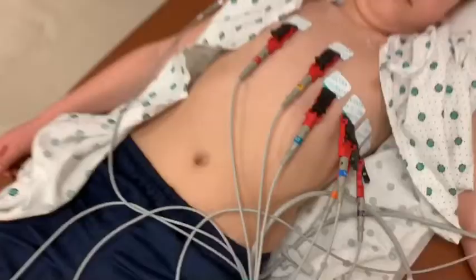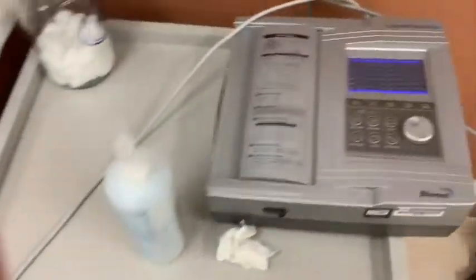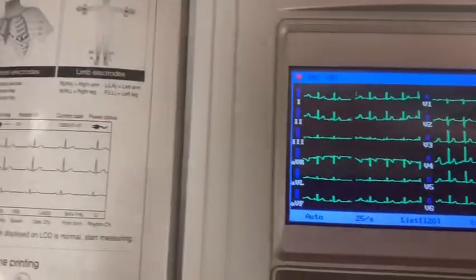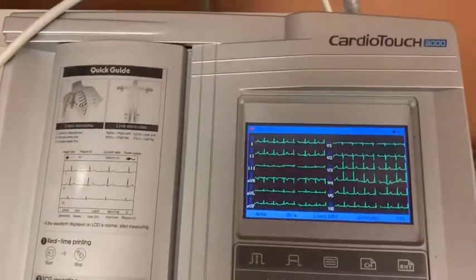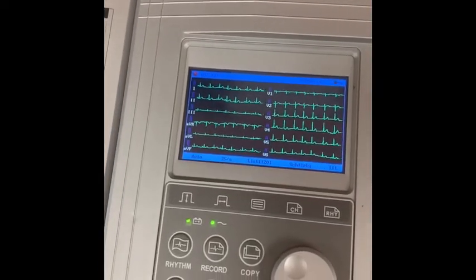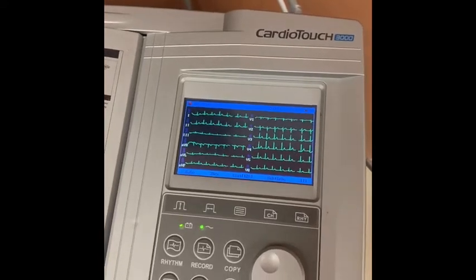So once my patient is completely hooked up like Colton is, we're just going to have them relax and not move — just go to a happy place for a second. If you look at the EKG monitor, that's a very good EKG. You can see the PQRSTs and a nice straight baseline. But right now I want Colton to wiggle around — if you see him wiggling around you can see that's a wandering baseline. Okay that's enough. And as Colton's back lying still again that wandering baseline and somatic tremor has disappeared. So we're going to have Colton lie nice and still and not talk for just a moment.